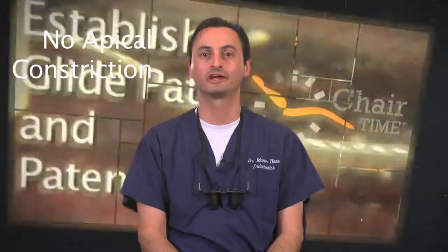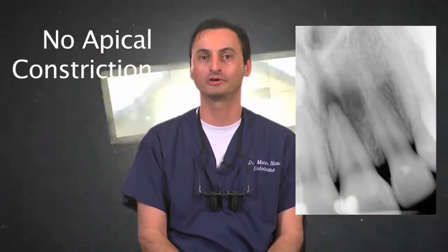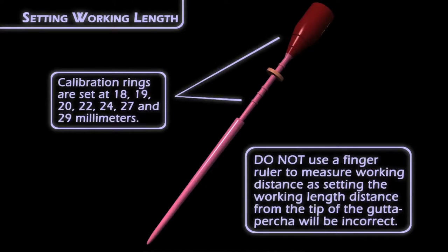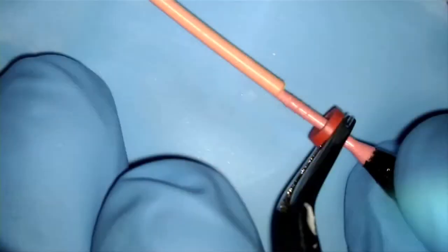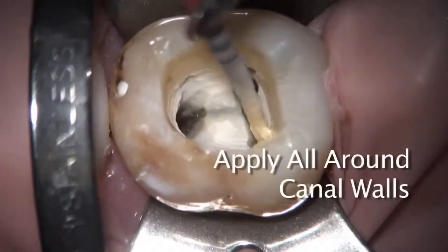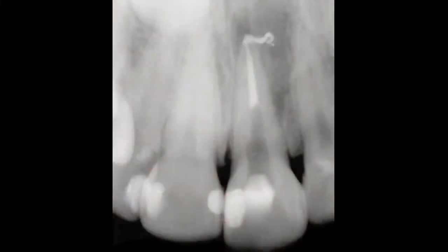Second, I'll speak about canals with no apical constriction. These include, but are not limited to, cases with apical pathology or canals you know have been instrumented large beyond the apex. In such cases, I recommend that you obturate at least one millimeter short of your working length, and remember to use very little sealer in these canals. This case of mine — a maxillary central with an apical lesion — demonstrates how using too much sealer and or not filling short of the working length could result in unintentional extrusion.